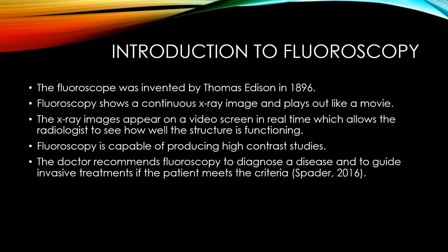Fluoroscopy is capable of producing high contrast studies, and the doctor recommends fluoroscopy to diagnose a disease and to guide invasive treatments if the patient meets the criteria.